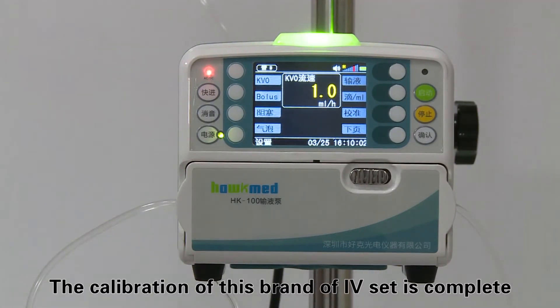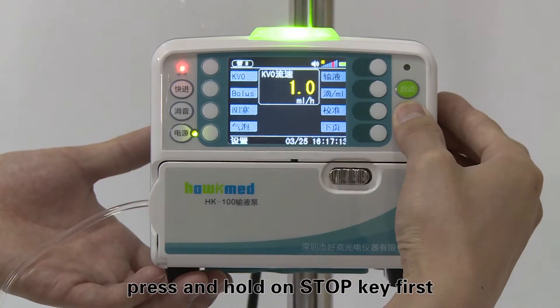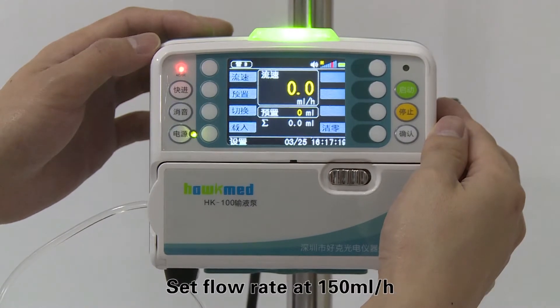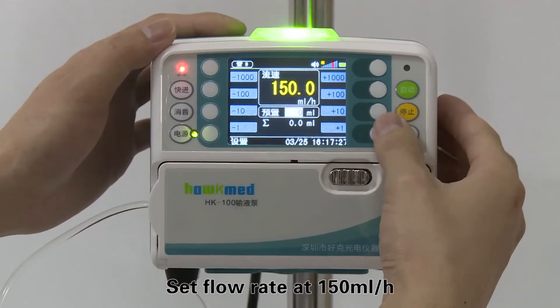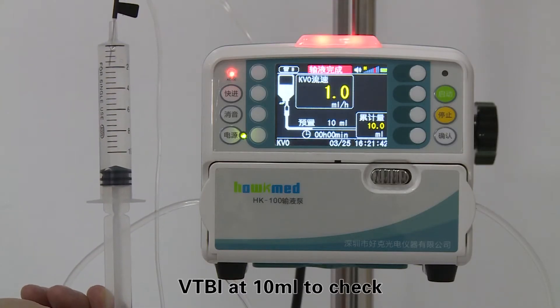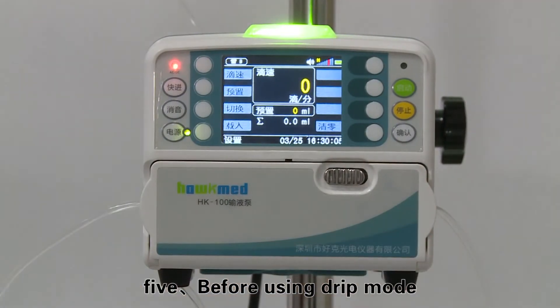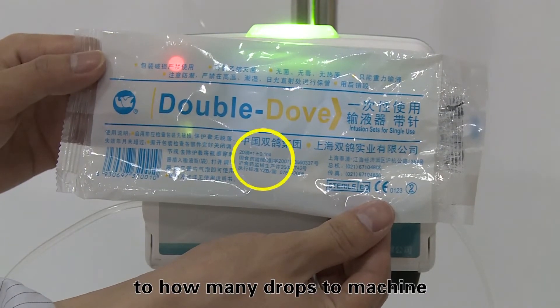Step four: after calibration, press and hold the stop key first, then press the first soft key on the top left to quit the parameter setting interface. Set the flow rate at 150 mL per hour and VTBI at 10 mL to verify that the actual infusion volume is approximately 10 mL. Step five: before using drip mode, input how many drops are equivalent to one milliliter into the machine.